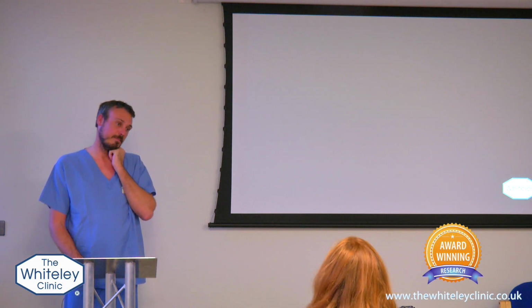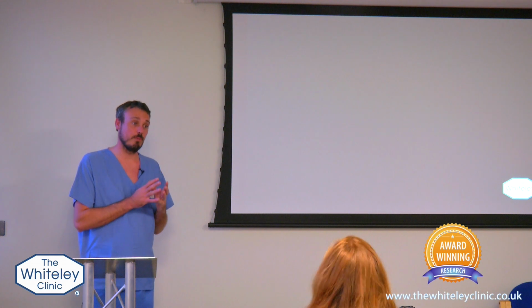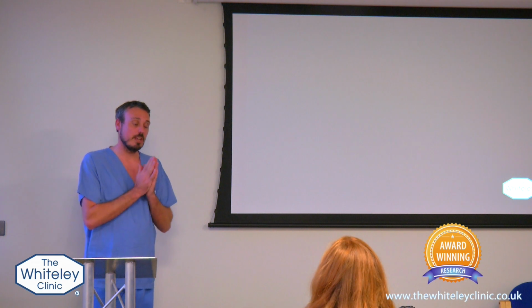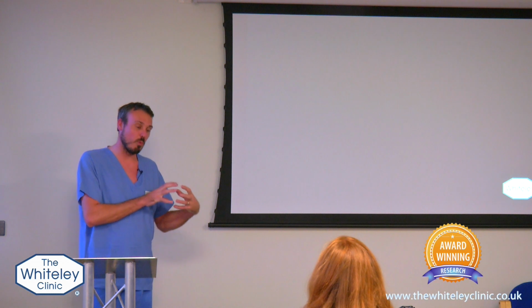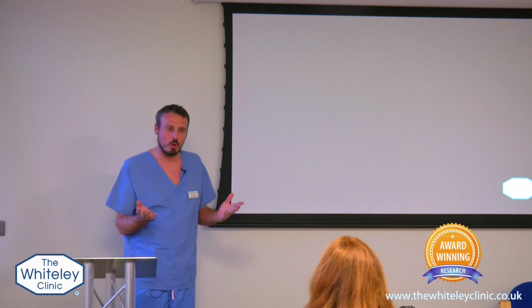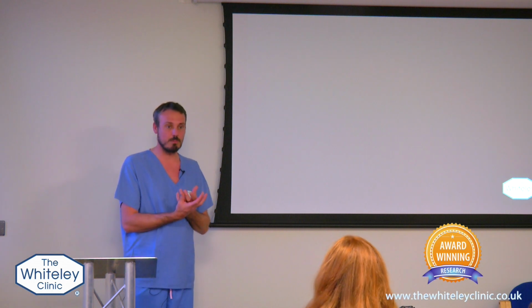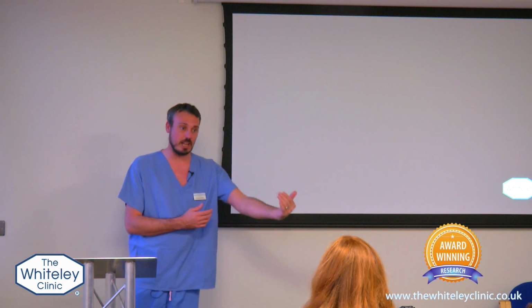And just the foam is not used. This is your question, I think, is because platinum's more reliable inside the body than the foam? No, the foam is used to cause a chemical burn. The foam will cause a chemical burn to the vein wall of the vein that you injected into. If it's rapidly excreted out of that vein, it's neutralised, but then that's not a normal vein. An abnormal vein will hold the foam, it will sit there and cause a chemical burn to the vein wall, so the reason to inject the foam is just to get that little bit more distal embolization.